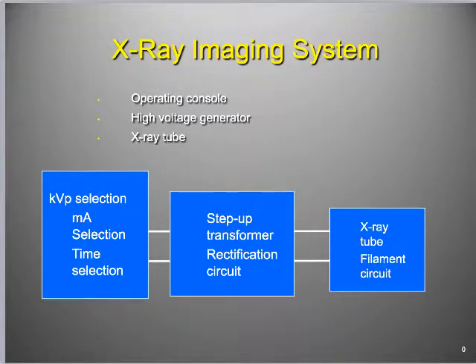But it is a high voltage portion. So we'll be talking about that. The final thing, the part that no one should be looking at funny, is the X-ray tube, right? Because not only is it high voltage, it's also kicking out radiation, right? So hopefully you haven't noticed any technologists hanging cup holders off of the X-ray tube or anything like that, but it's there as a safety consideration that we have these things broken up into these sections.